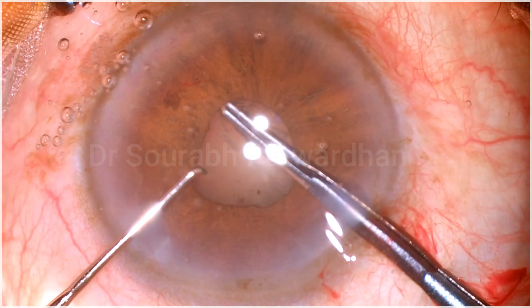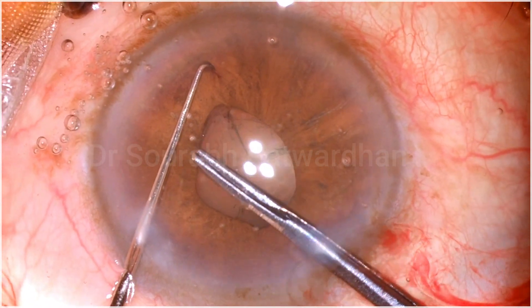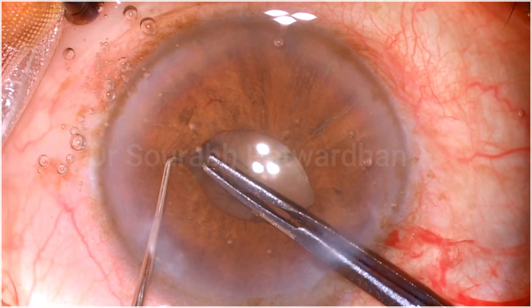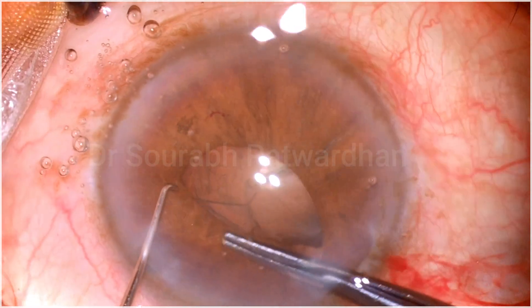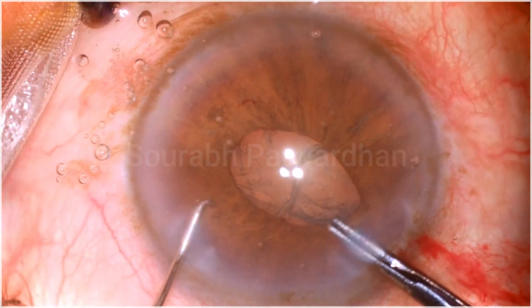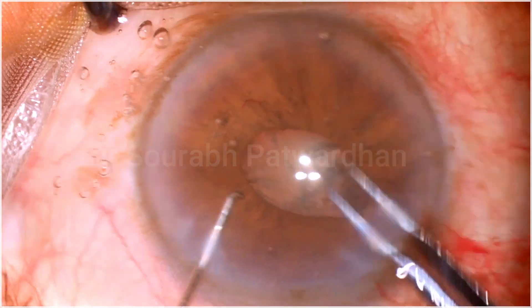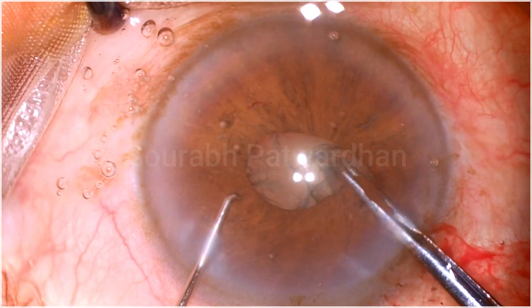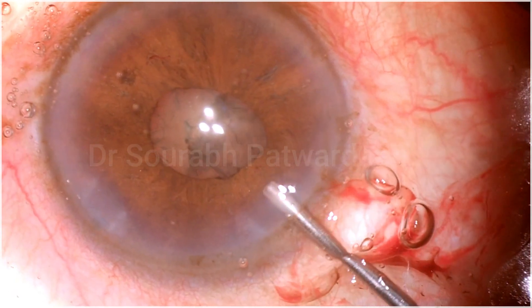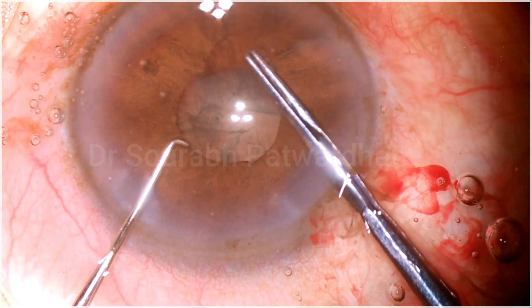It is not a very rigid pupil and the iris has a tendency to prolapse. Here I would say that I should have used a pupil expansion device or iris retractors. But I went ahead with doing capsulorrhexis and I realized that probably it is not a good idea because it is not a rigid pupil. Sometimes if you have a rigid pupil, you can do capsulorrhexis under the iris easily. But here the pupil is becoming smaller and the iris is trying to prolapse from the main incision.